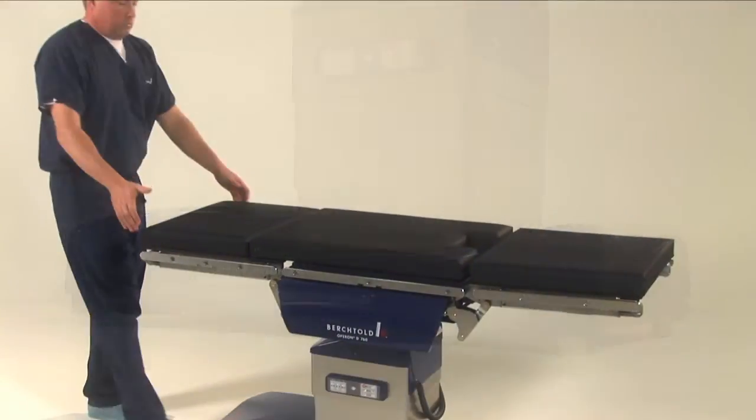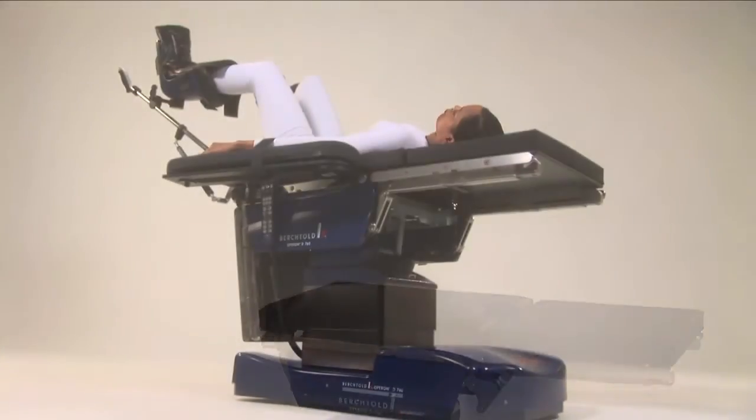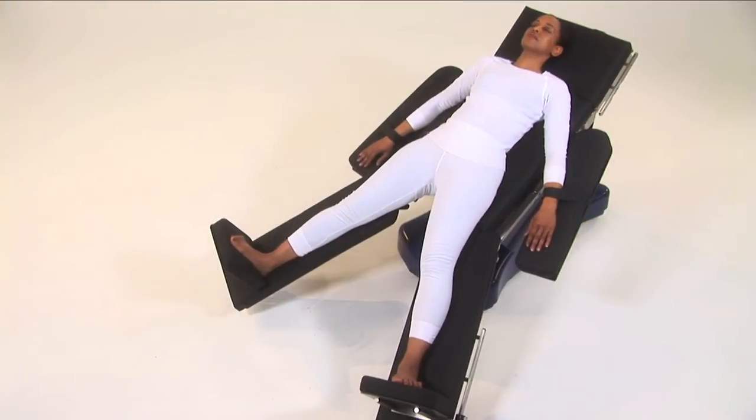The detachable back and leg sections create optimal site exposure and accessory possibilities. A complete line of available accessories allows the D760 to accommodate virtually any surgical procedure.